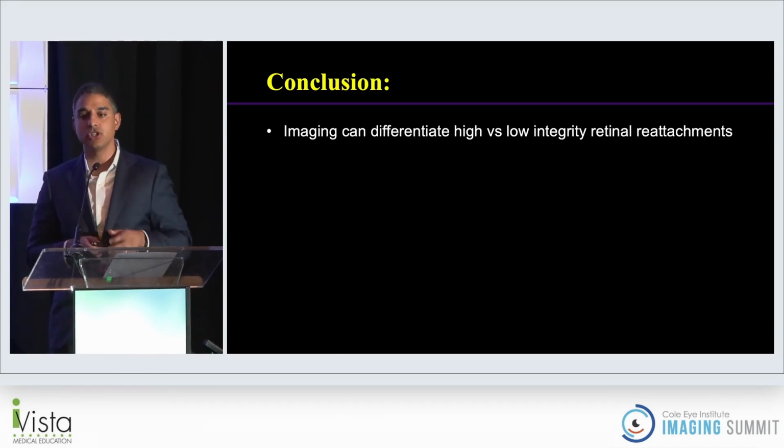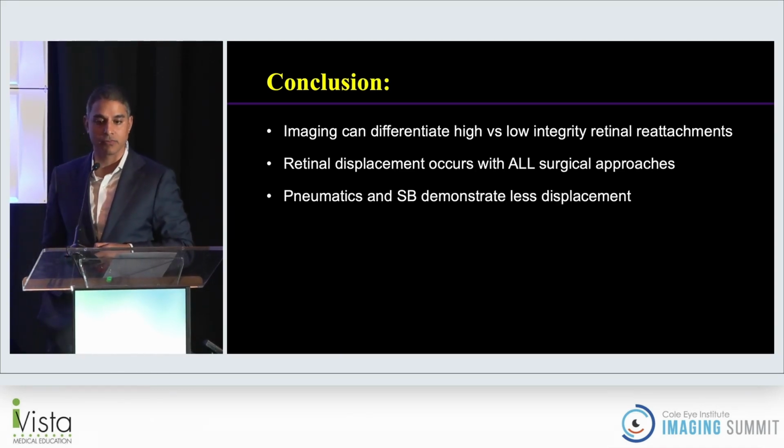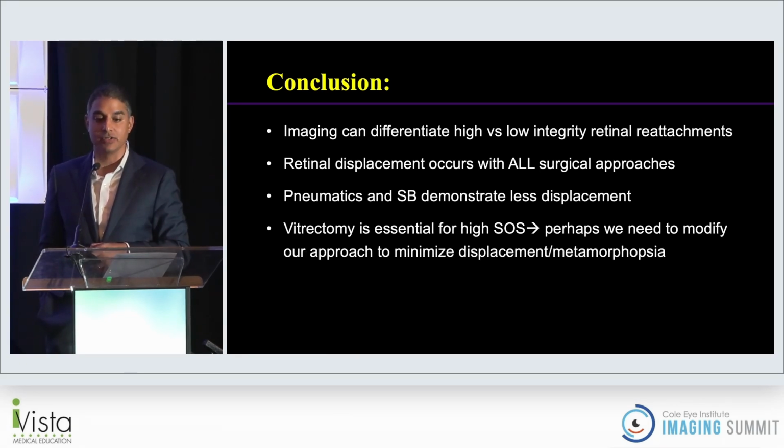So in conclusion, imaging can differentiate high versus low integrity retinal reattachments. Retinal displacement occurs with all surgical approaches. Pneumatics and scleral buckle may demonstrate less displacement, and vitrectomy is essential for high single operation success, and perhaps we need to modify our approach to minimize displacement. Thank you.